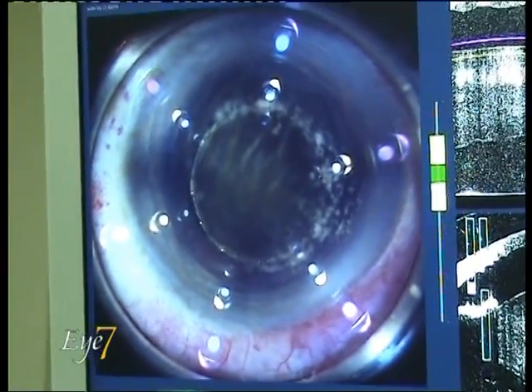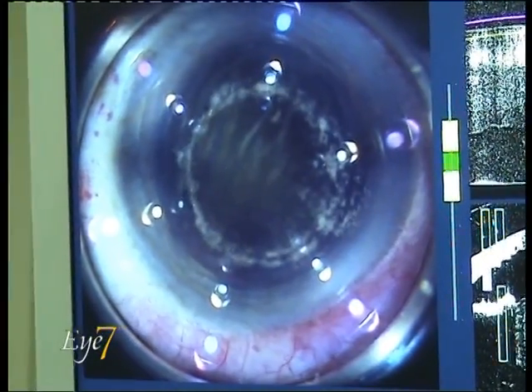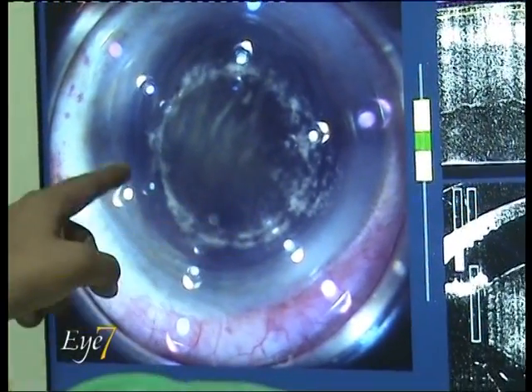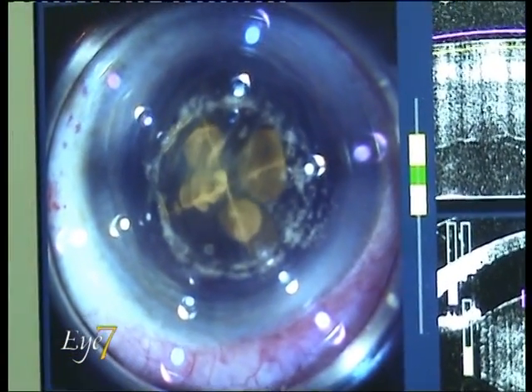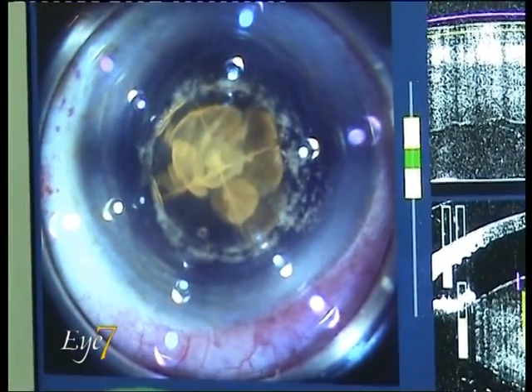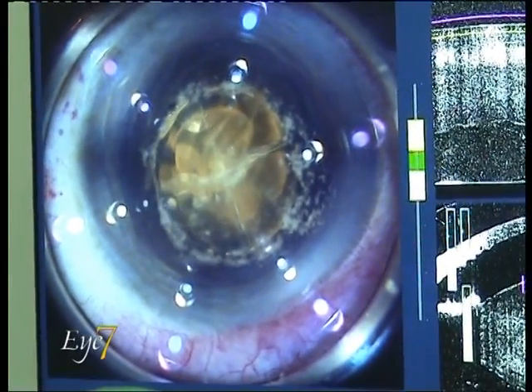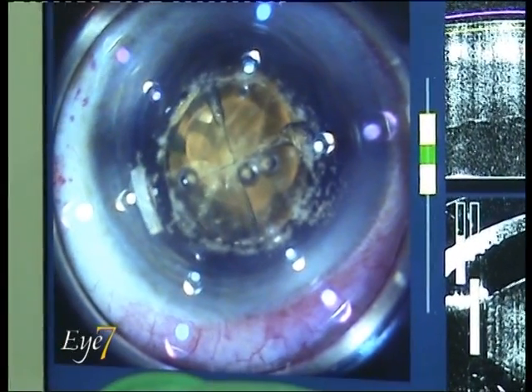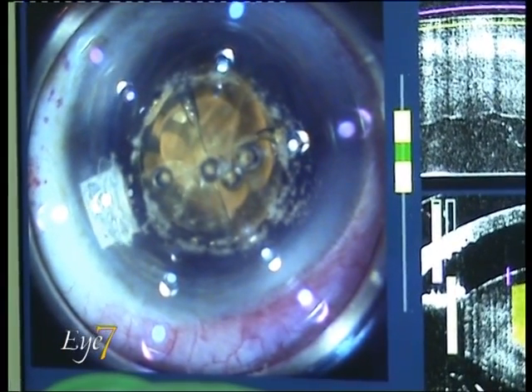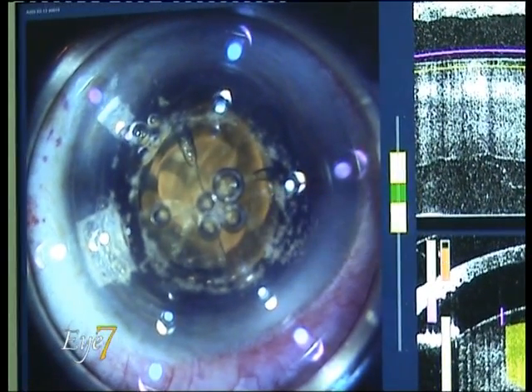The laser starts moving within the eye and you can see this circular impression — this is the femtosecond laser cutting the anterior capsule. After that, this cruciate incision is seen as the yellow incision; this is where the laser is cutting the nucleus into four pieces. You can see a lot of cavitation bubbles coming up, and some bubbles are even escaping out into the anterior chamber.